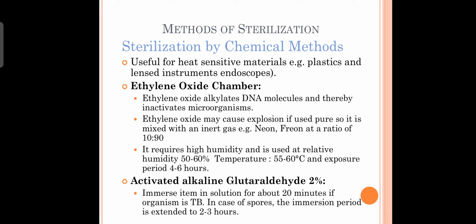The second chemical is activated alkaline glutaraldehyde 2%. Immerse the item in the solution for about 20 minutes if the organism is TB, that is tuberculosis, Mycobacterium tuberculosis. In case of spores, the immersion period is extended to 2 to 3 hours.